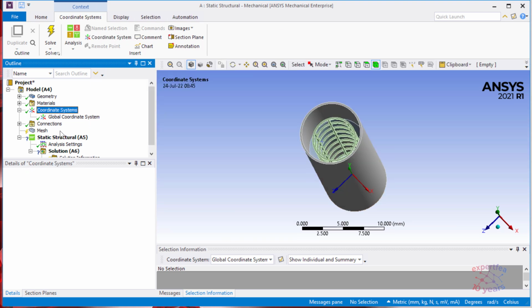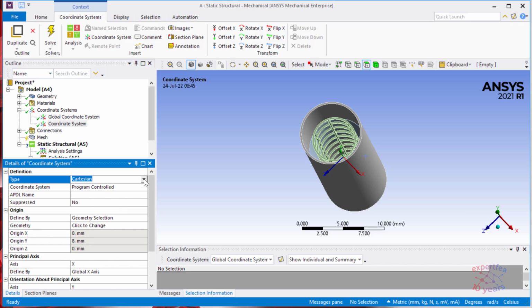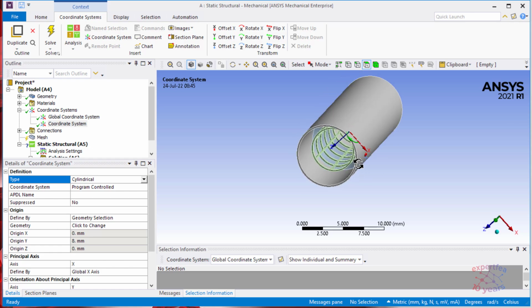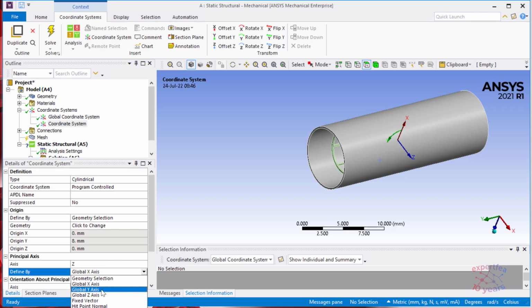Let's go for coordinate systems. I will create a new one. Click the outer face of the blood vessel and change its type from Cartesian to cylindrical. We kind of need to have a radial displacement, so the rotation should not be as shown here, but should be on the plane XZ that we have now. The easiest way is to assign the Z-axis aligning to Y absolute axis. So let's go here from the relative Z-axis and align it to global Y-axis.